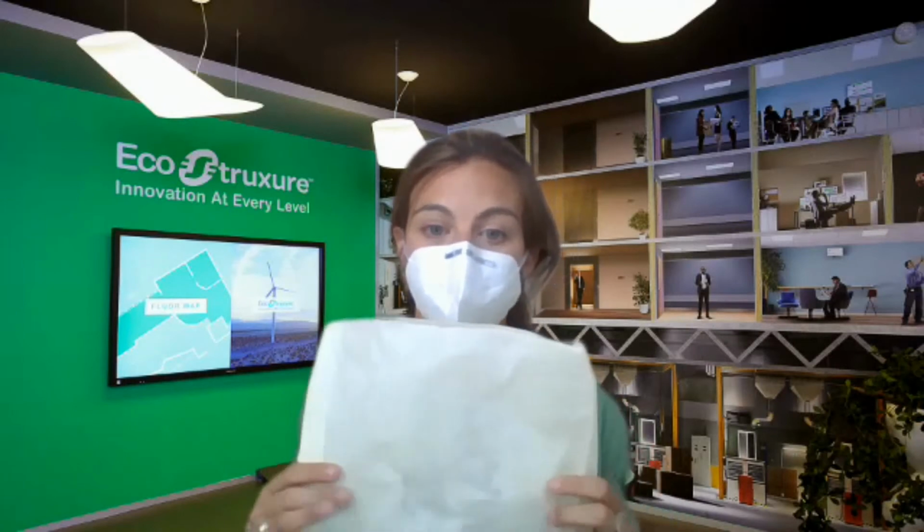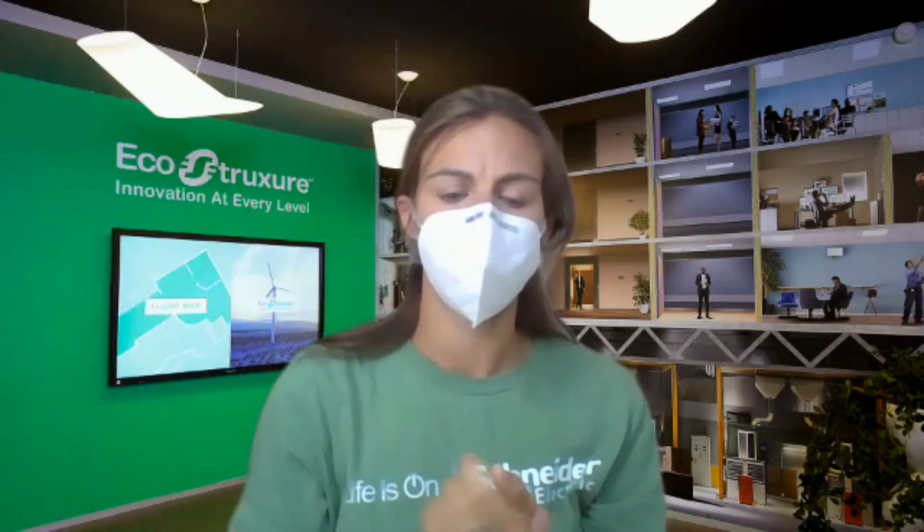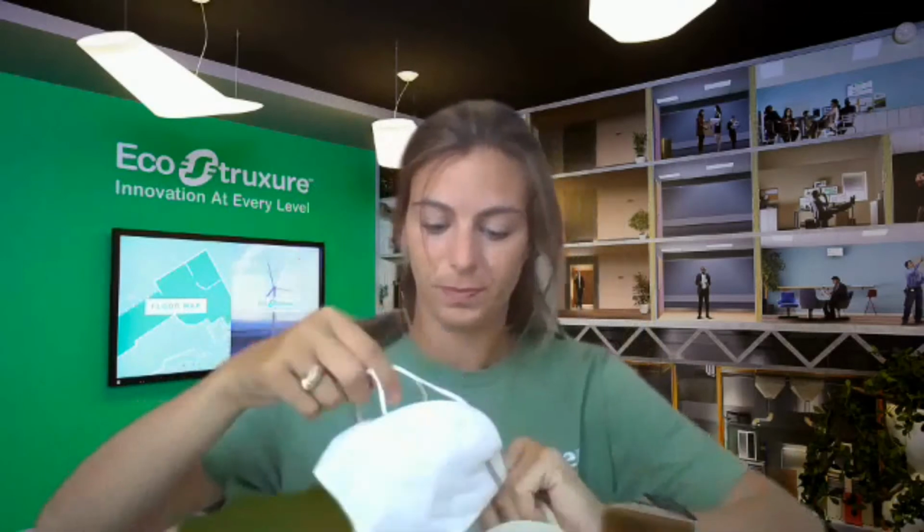Make sure that you wash your hands for yourself and others prior to each removal and redonning of your mask. I'm opting for a paper bag as my storage, but you can store in paper or cardboard, anywhere that does not provide a chance of exposure for others and provides moisture wicking to avoid bacterial buildup. At the end of the workday, when my shift is over, I will rewash my hands, take off my mask, and place it into that bag. Each time I put my mask on again, I am ensuring that I sanitize and refit properly.